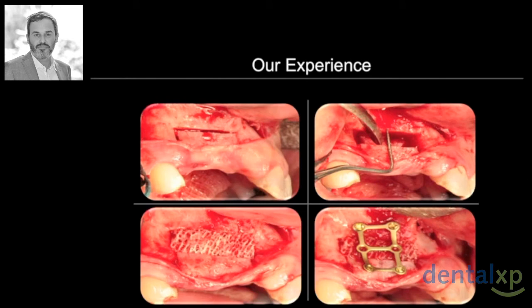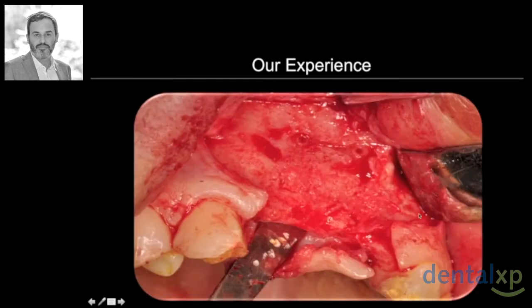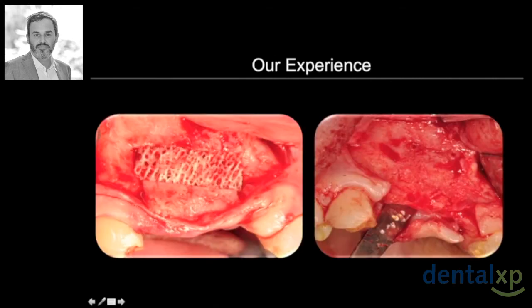This technique also works in the superior maxilla, like this case. Here we see an opening after 3 months. The bone block is not visible. And in this picture, you understand what I mean. Before and after.